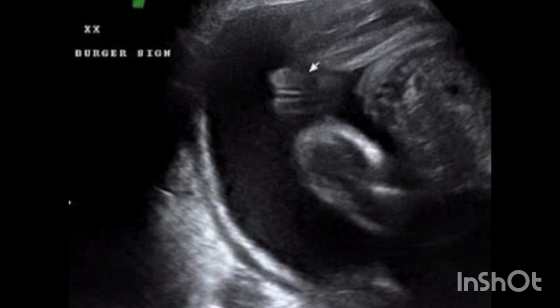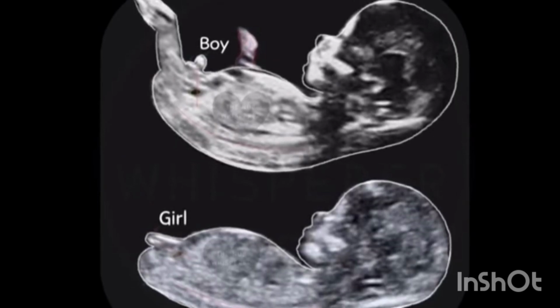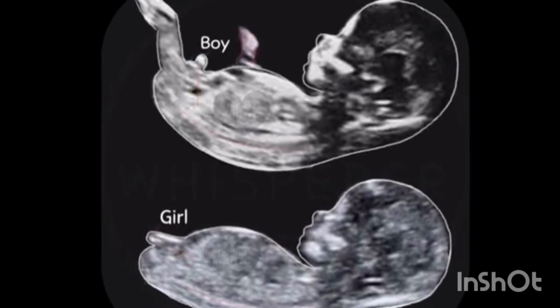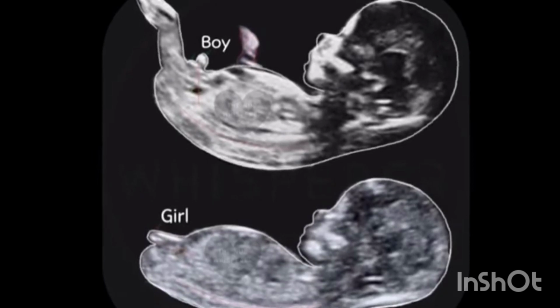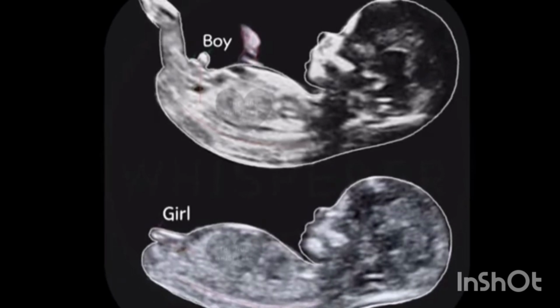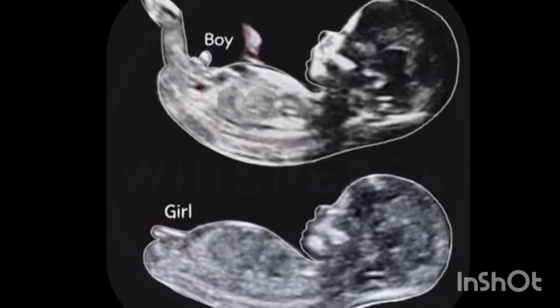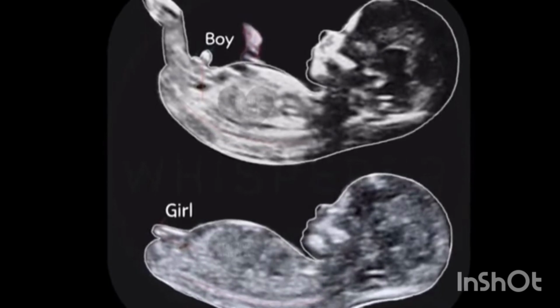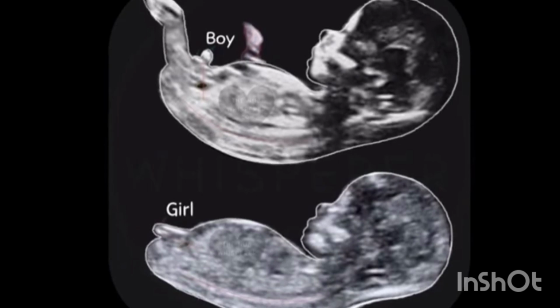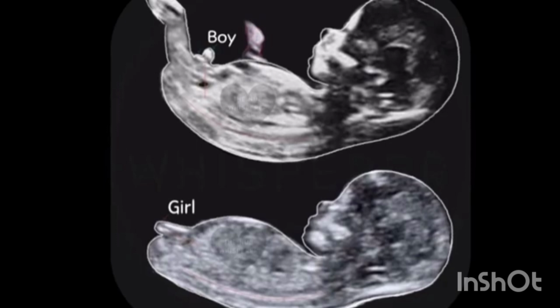When you have your ultrasound done, remember that while the technician's call is usually right, sometimes mistakes happen. There are many reasons why your ultrasound might be wrong when it says girl or boy. These possible hiccups are usually controlled for in a variety of ways, but also you should have the limitations of your exam explained to you in a way that you can understand. Understanding the limitations of ultrasound technology will give you a better idea of how seriously you should take the results and how much decorating you should do in the baby's room or in a baby's wardrobe.